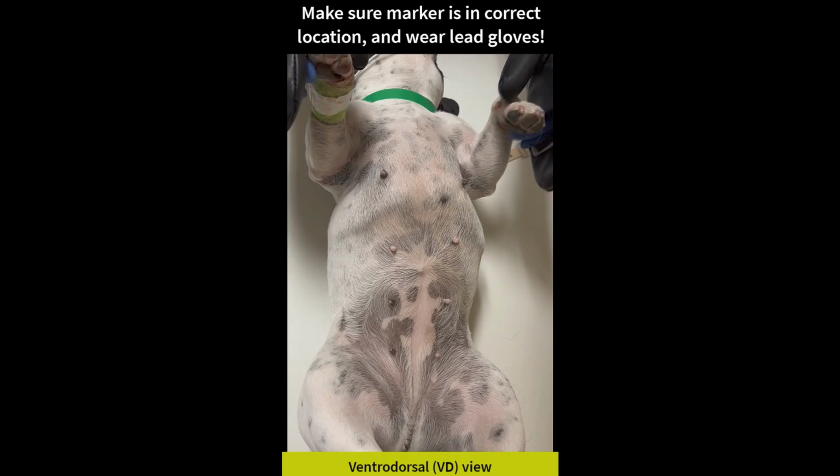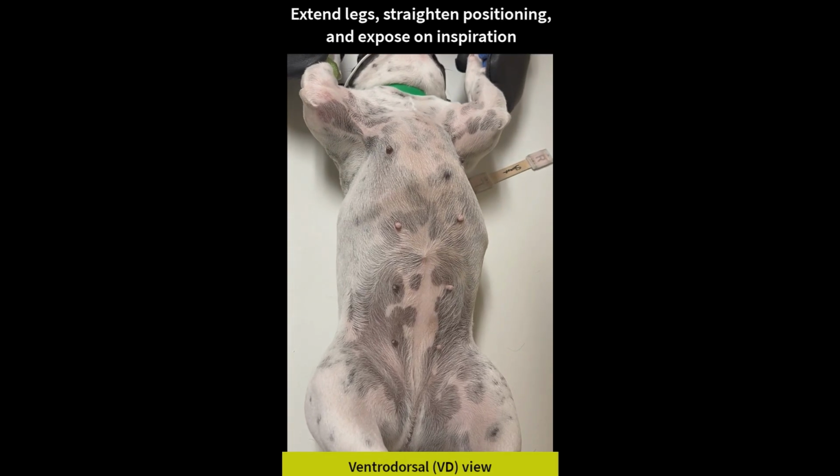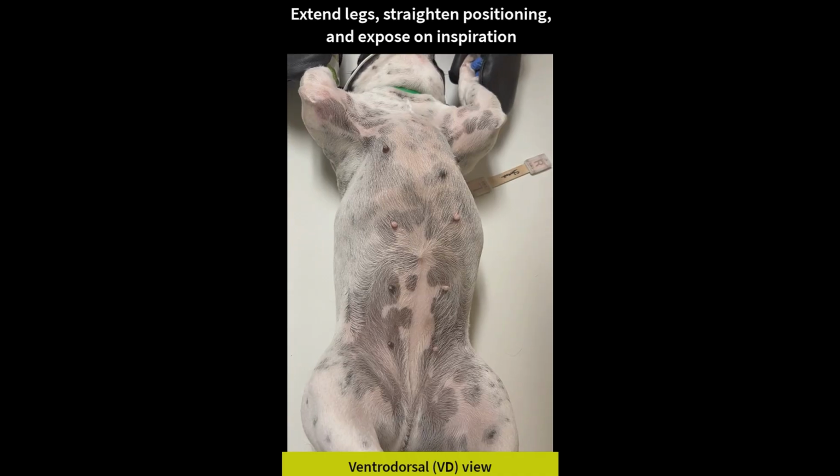As before, staff involved in patient restraint should have appropriate protective equipment including gloves and should not be exposed to the primary beam. Extend the limbs, maintaining straight positioning. Radiographs should be acquired during the inspiratory phase.